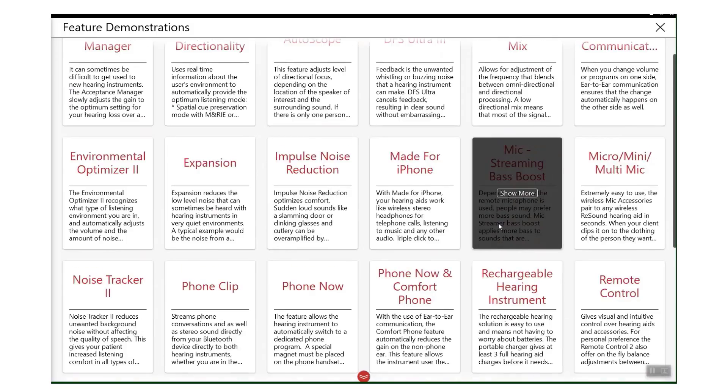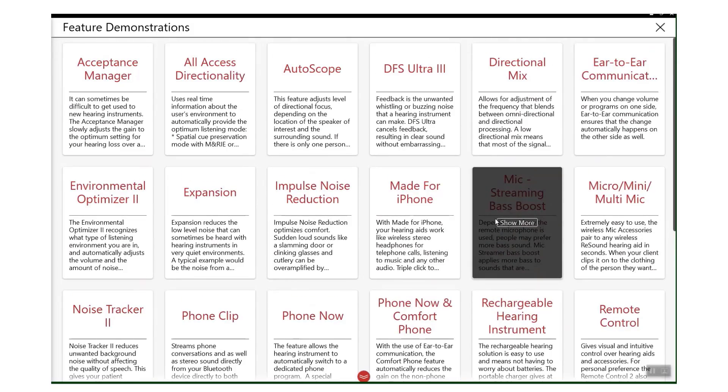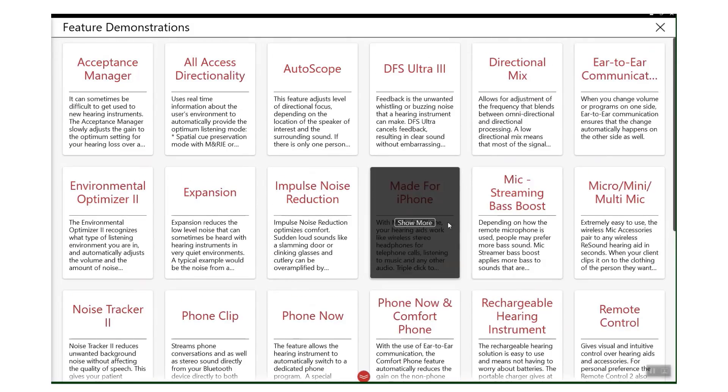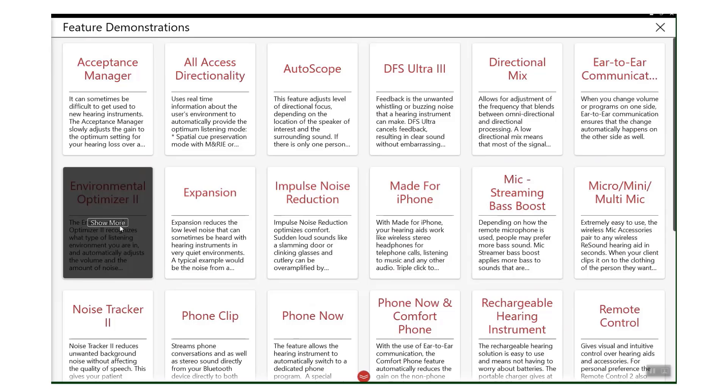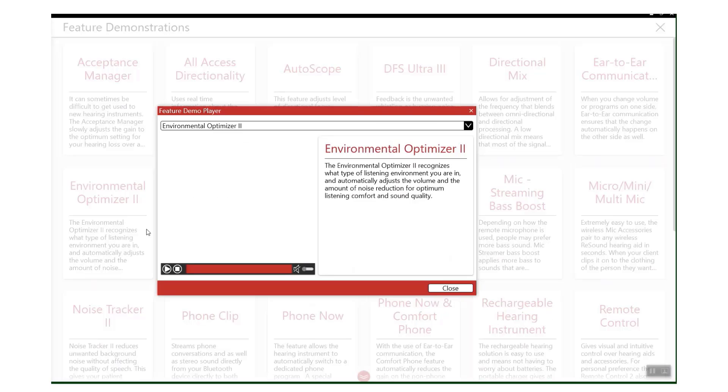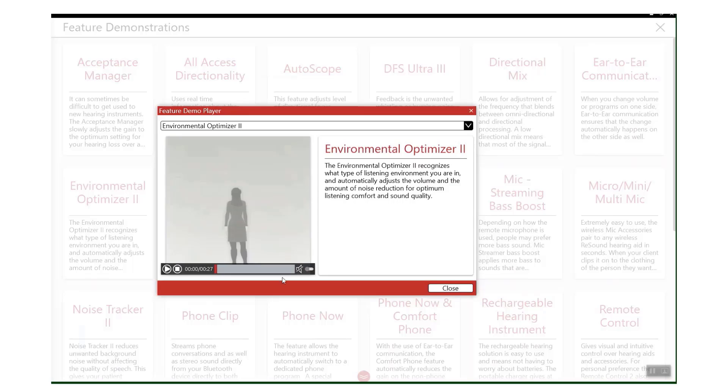For example, if I click on Environmental Optimizer 2, this will show me exactly what it does and give me a short video to play as a little bit of an explanation.